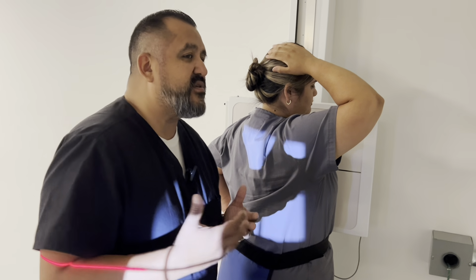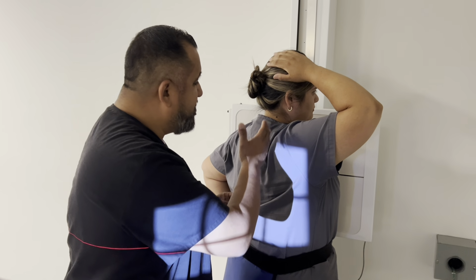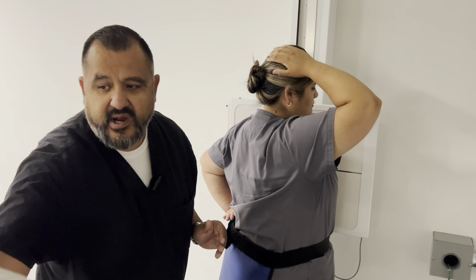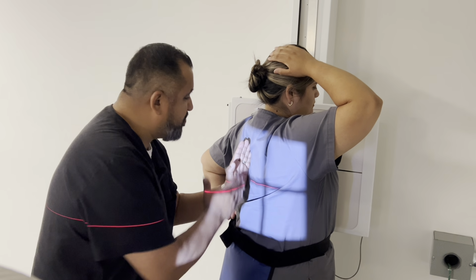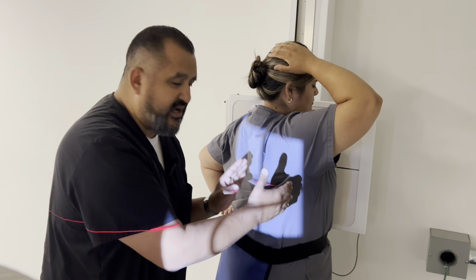And I want you to understand the reason for that. If you were to do an RAO for the right lung, the spine's going to superimpose over the area. So this is the reason why we do an LAO, because now the spine's over here and it allows us to capture the anatomy on that right side.